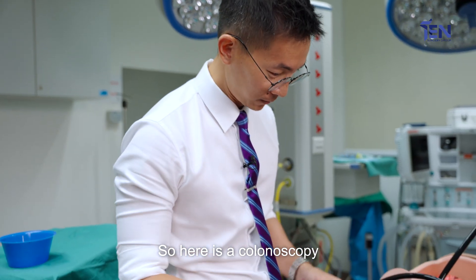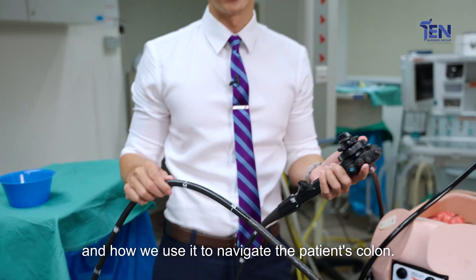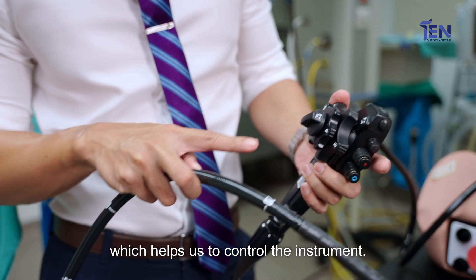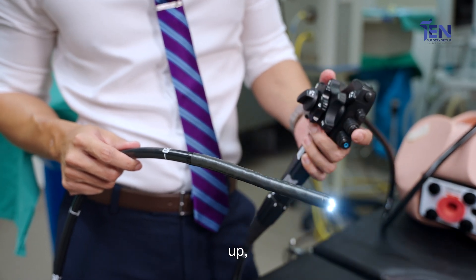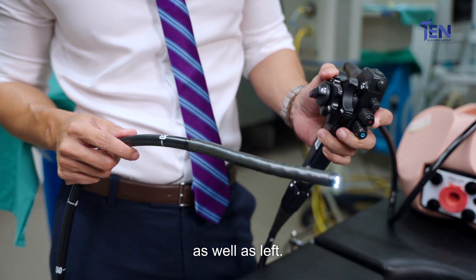Here is a colonoscopy and I'm going to show you how the controls work and how we use it to navigate the patient's colon. If you look here, this is what we call the dials which help us to control the instrument. With the instrument, we can turn it to go down, up, right as well as left.